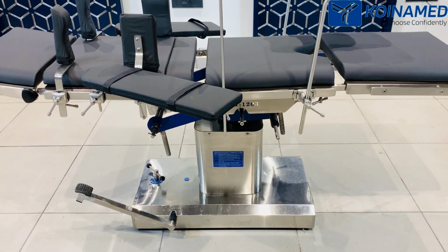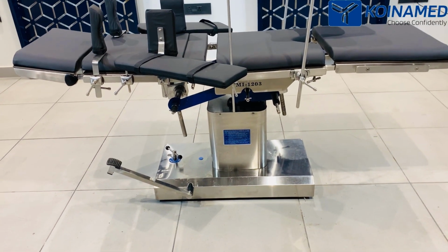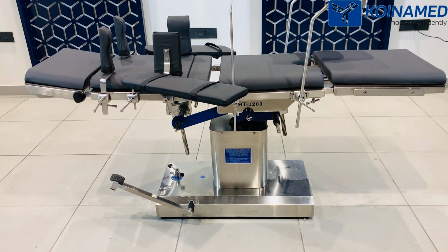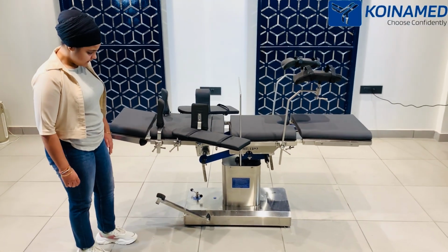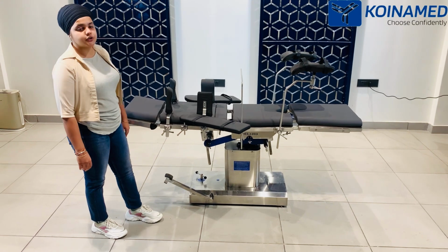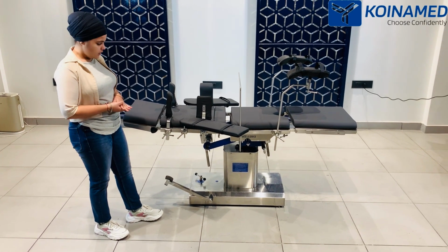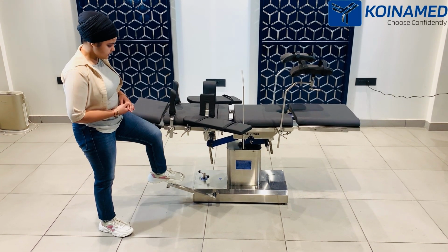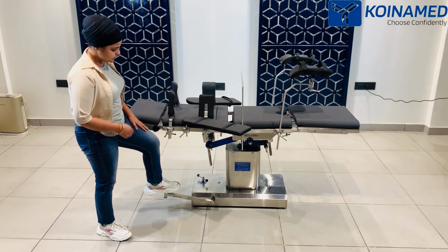This is a central pillar operation table for general surgeries. As this is a hydraulic operation table, you have to do the up and down with the help of a pedal. This kind of pedal will be provided to you. When you have to make the table go upwards, you have to press it a little bit, just like this. You can see the table is going upwards.